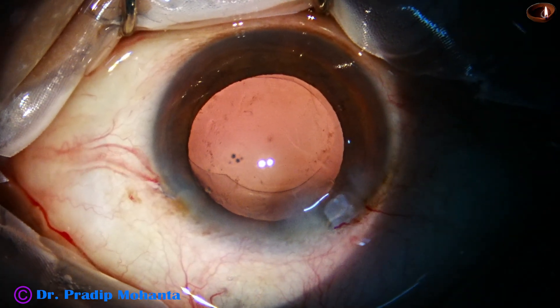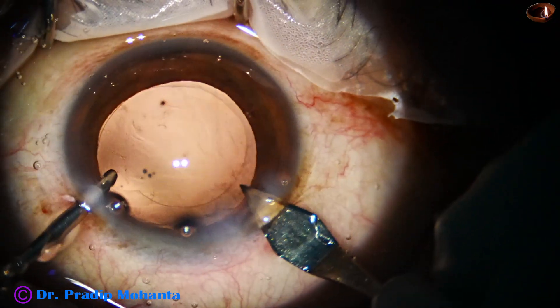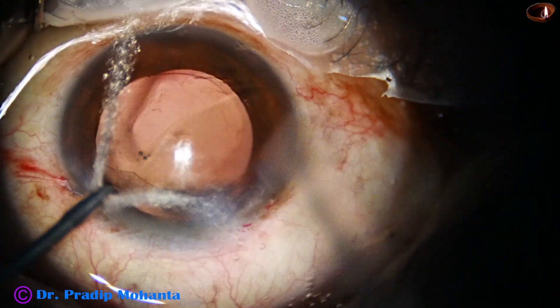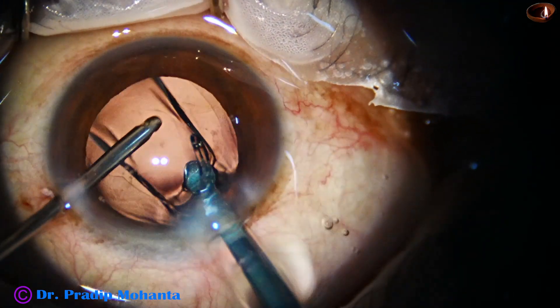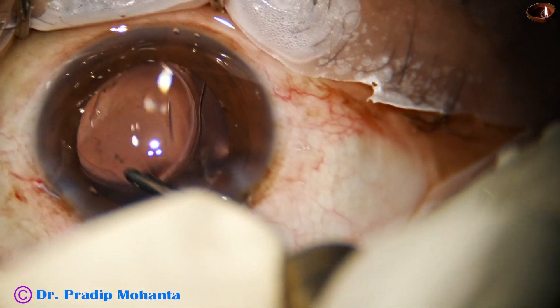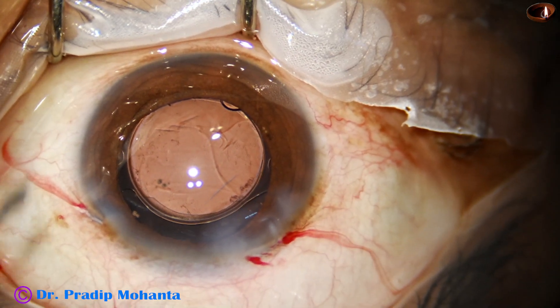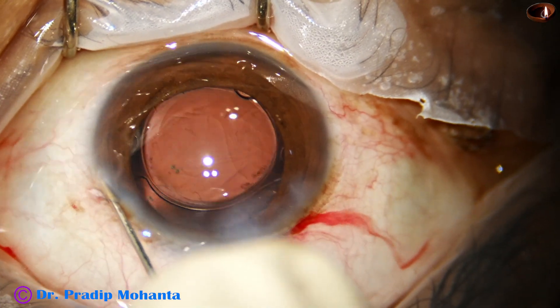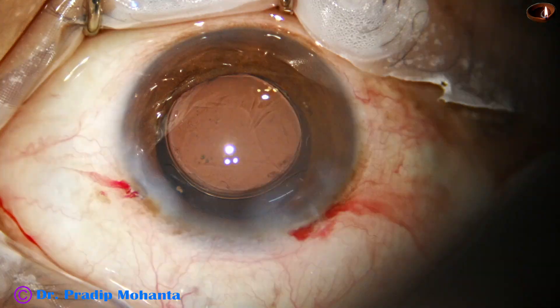Cortical cleanup has been done — a nice, clean posterior capsule. Now the main wound is being enlarged to about 3 mm because I am using a B-cartridge. A single-piece monofocal intraocular lens is now inserted. The irrigating probe is used. A portion of the haptic is attached to the optic but will get detached very soon. The side port is closed. The haptic-optic attachment is now gone, and the lens is more central.